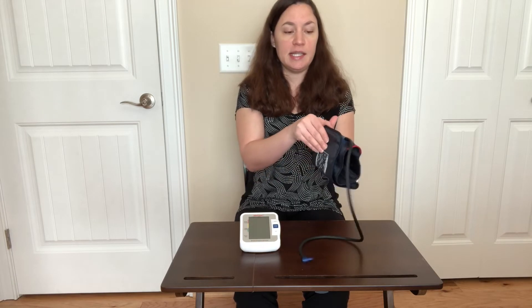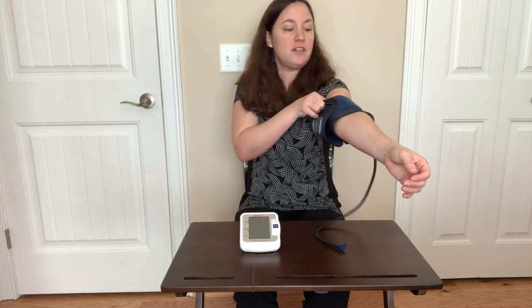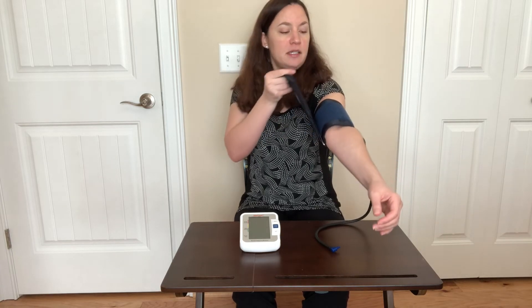Then what you'll do is take this adjustable cuff and put it on — preferably your left arm — two to three centimeters above your elbow, and make sure that the pipe is directly in the center of your arm.